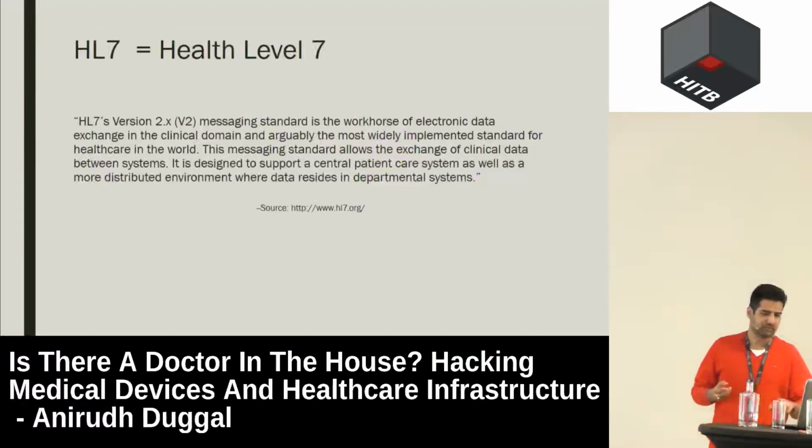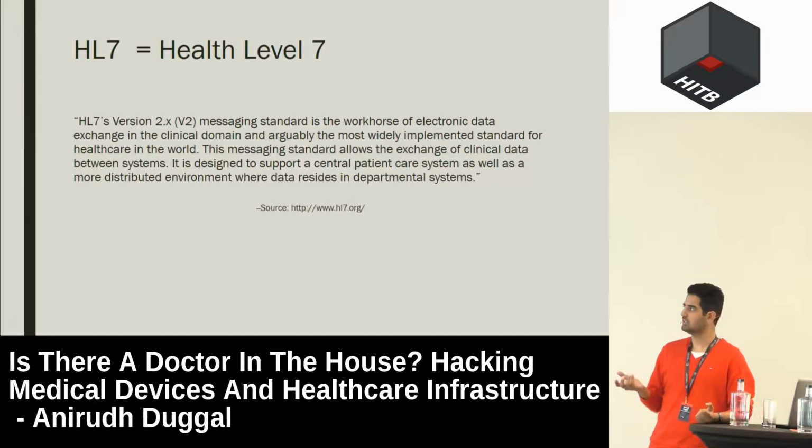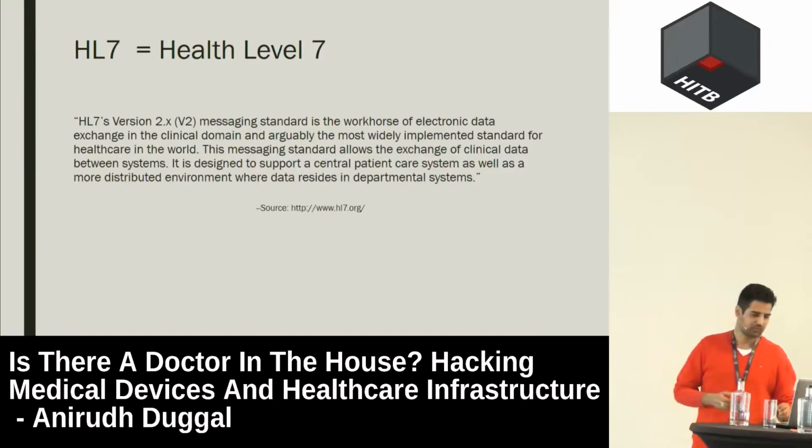The other part of it is HL7 2.x. And what is it? HL7 stands for Health Level 7. It's an association, something like W3C is. They create standards for medical devices and interoperability. And so you can read through it.